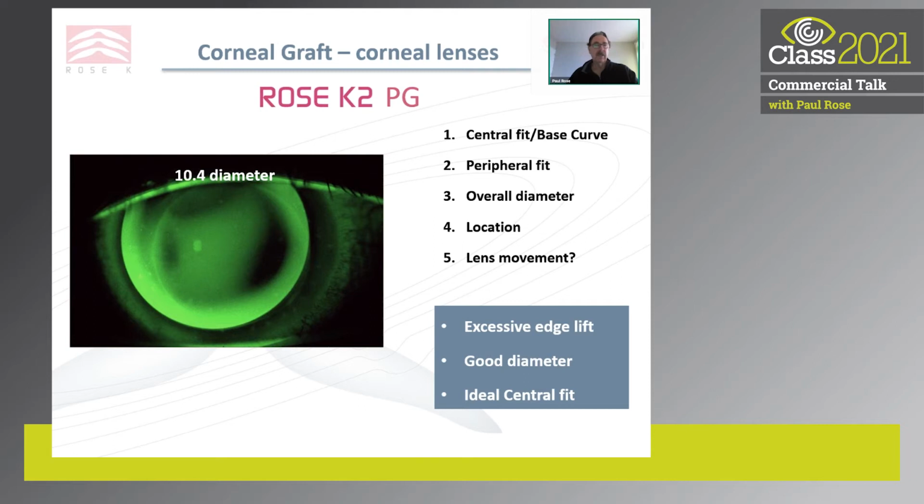The patient was happy. And one thing it did teach me is that in grafts, you are better to have excessive edge lift than a closed edge lift. That will cause you much, much more problem than an open edge lift like you see here. So in this case, if I was going to make a change, I would simply have ordered a decreased edge lift.